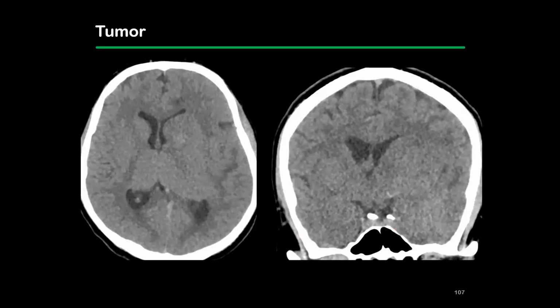Tumors can be tricky by head CT. We're often looking for asymmetry or secondary signs, especially if it's a low-grade tumor. So this was a glioma involving the left frontal and temporal lobe, and you can still see some gray-white differentiation, but this looks a lot bigger than on the contralateral side. It seems like there is some mass effect on the adjacent lateral ventricle.